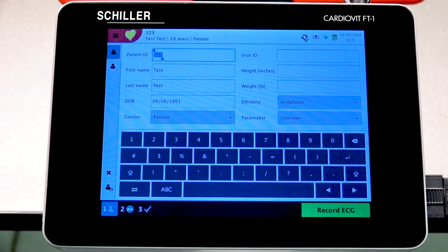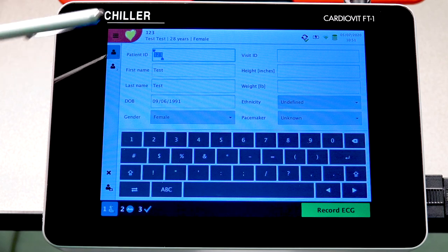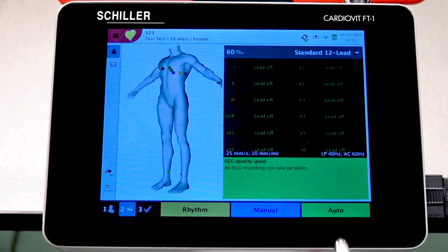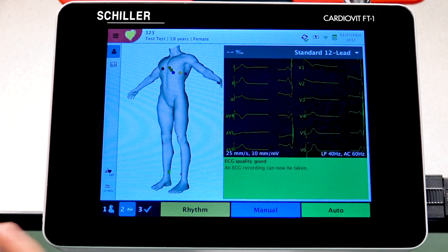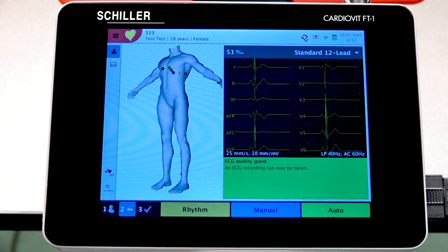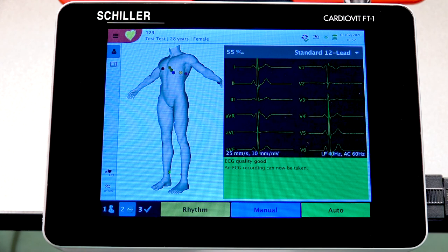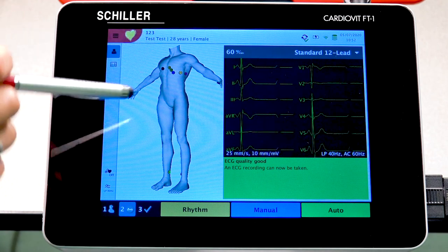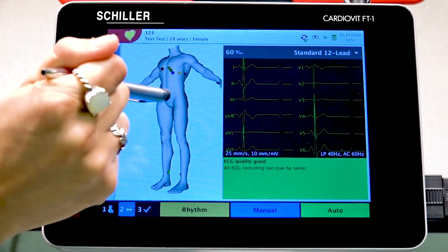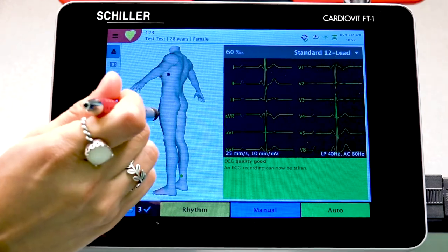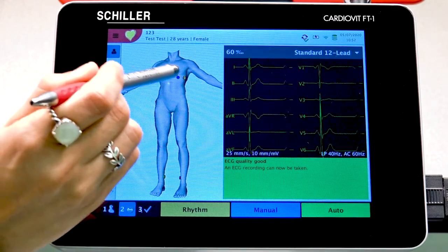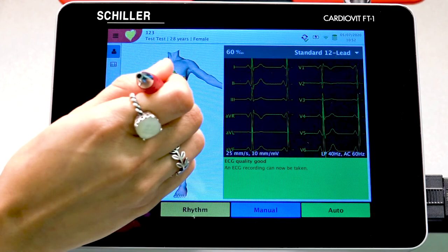Let's move forward with demonstrating how to perform a resting ECG. Once your patient information is properly entered, go ahead and select Record ECG at the bottom, and that will take you into your electrode placement verification screen. You'll see a human body on the left that you can rotate to verify electrode placement.